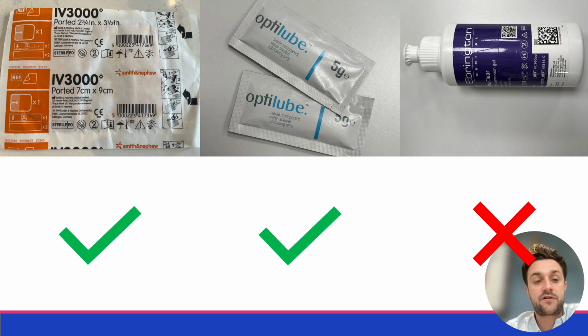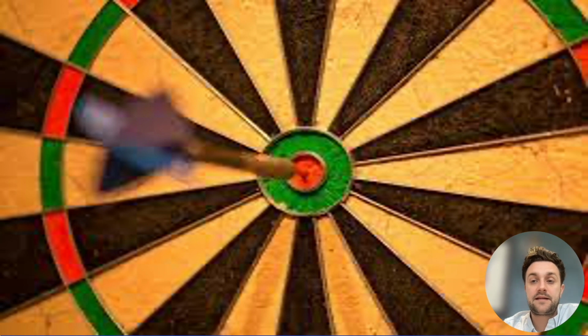And additionally, whenever you're starting, you can take a cannula dressing, and the see-through part of it you can put onto the probe, which will help keep it clean. Obviously, you will need to make sure that the probe is clean before starting, and clean the arm as well. The way that I do it is that I get my alcohol wipe, clean the entire area of the arm that I might be interested in, and then put the jelly on.